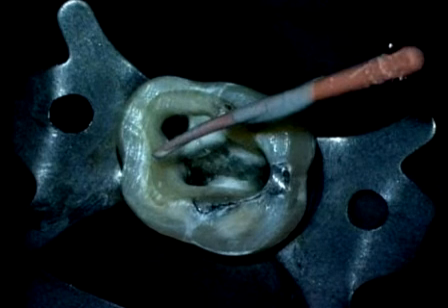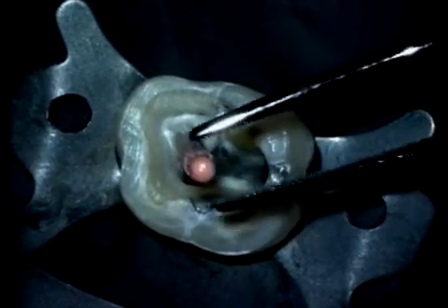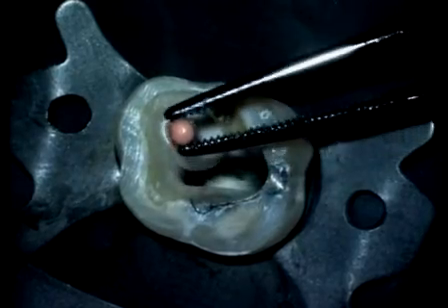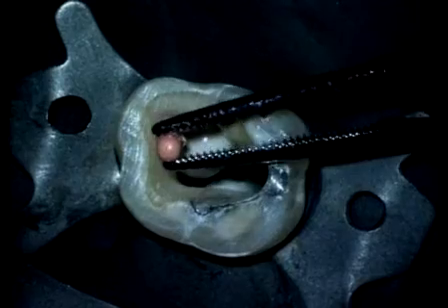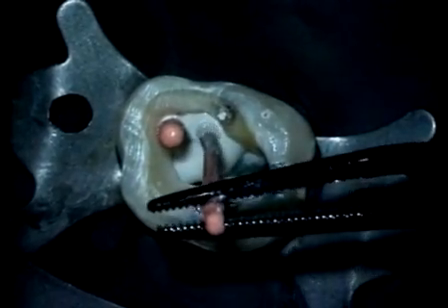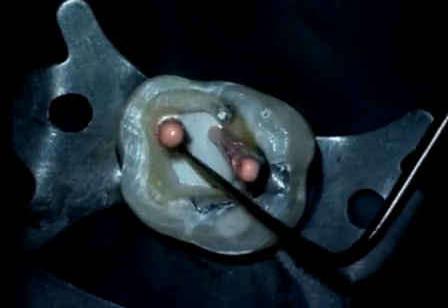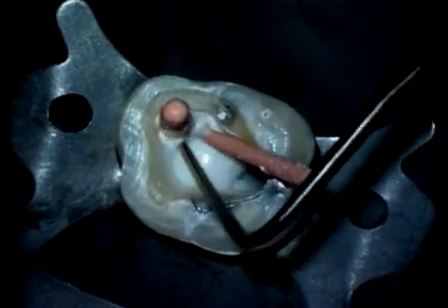In the event there is an area that is devoid of sealer, then rebutter it and gently tease it back to place. This allows air to move more effectively out of the canal. The MB2 is also buttered and seated against the apical extent of the MB1. The touch and heat is activated and utilized to sear off the non-useful part of the master cones.